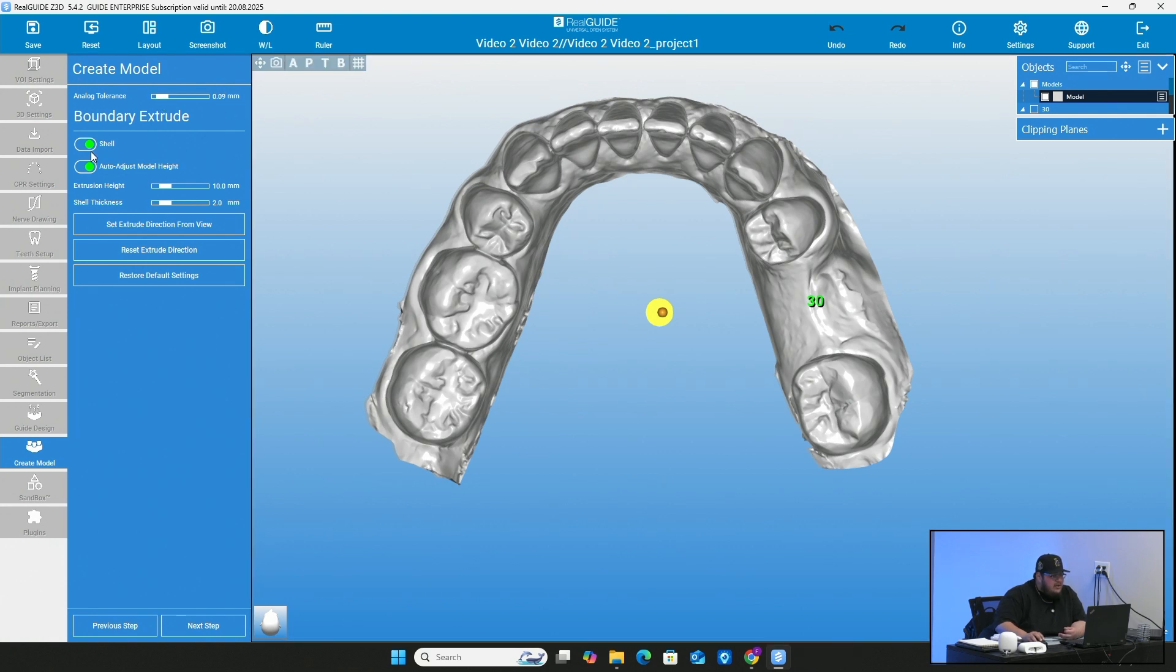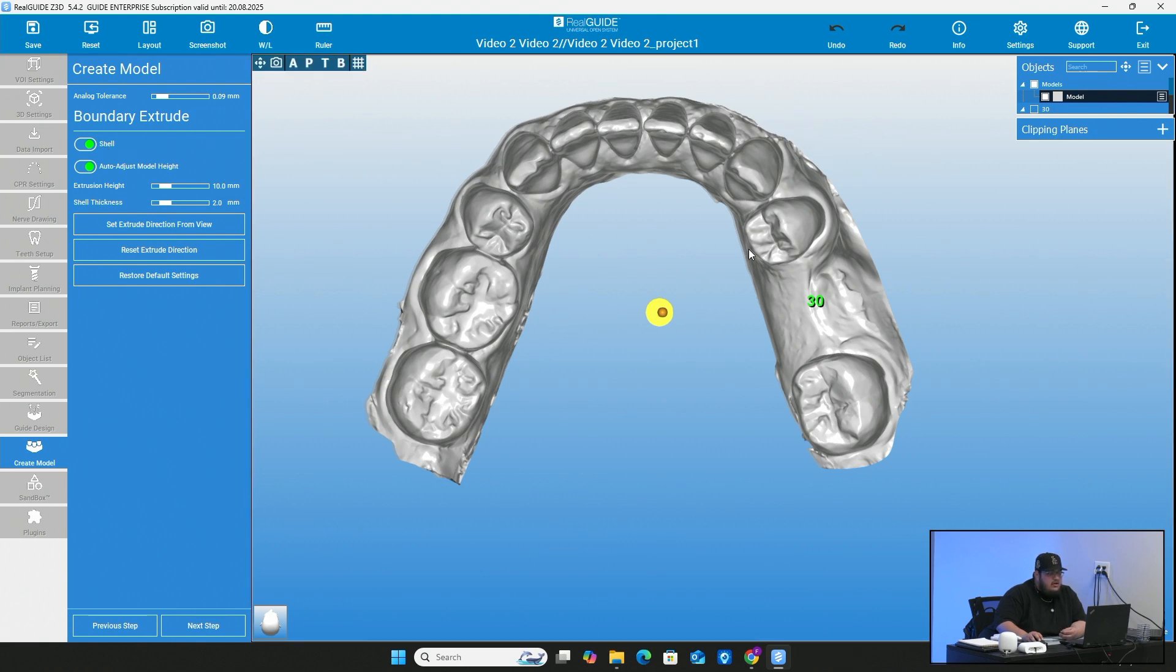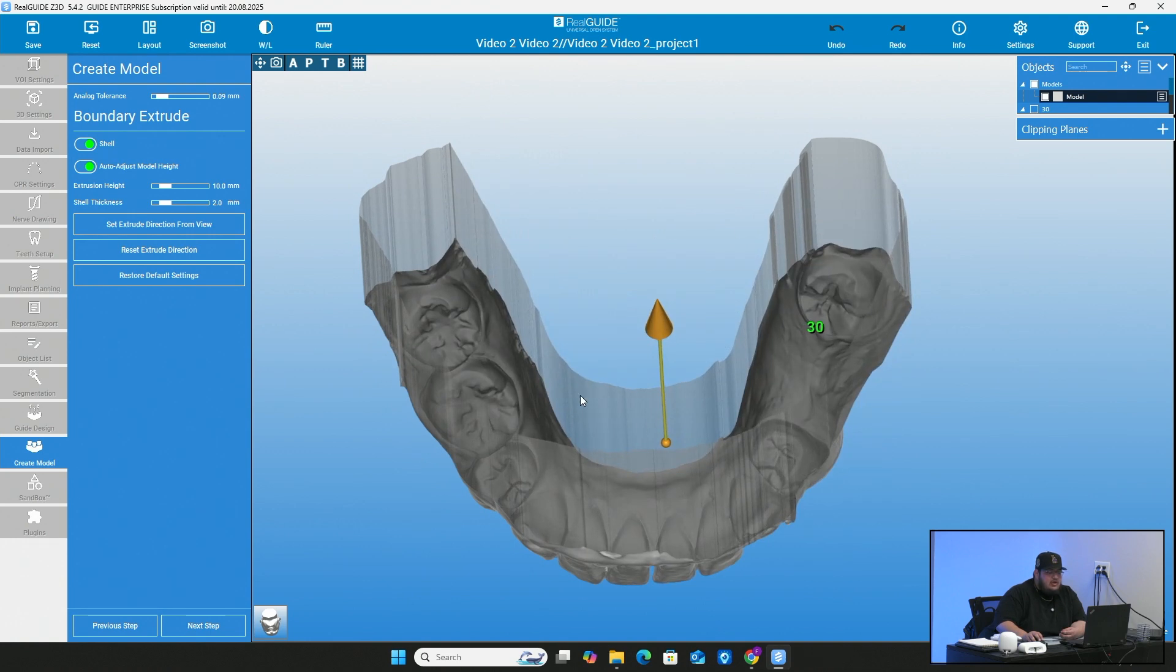So right now here at the bottom, we have this little toggle right here for shell. All this is going to be is whether or not you want this to be hollowed out. I would always recommend to hollow it out because it does take less material from your printers when it is hollowed out to create the model. We've learned that doing these models a lot here at the laboratory. And we noticed that if we keep it closed, it does take more material. And of course, more material does add up to more money.